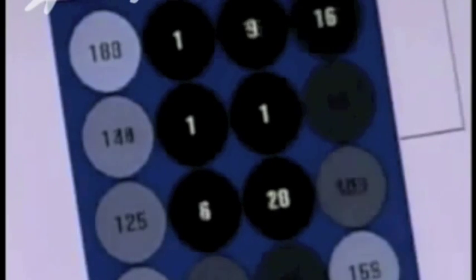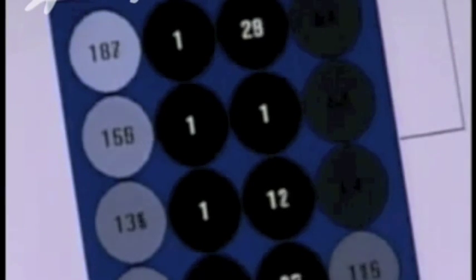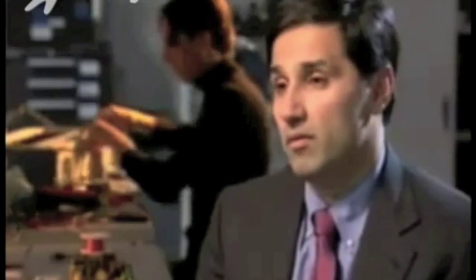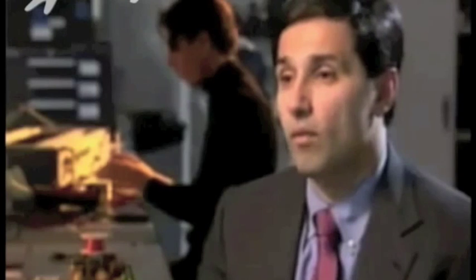Each circle represents one of the 16 electrodes on the implant. With 60 electrodes, the new implant should provide much better definition like this. We hope that it'll provide orientation type vision, allow these subjects to not bump into tables, chairs, be able to know where the doors are, where the window is, be able to even recognize the overall form of a person.